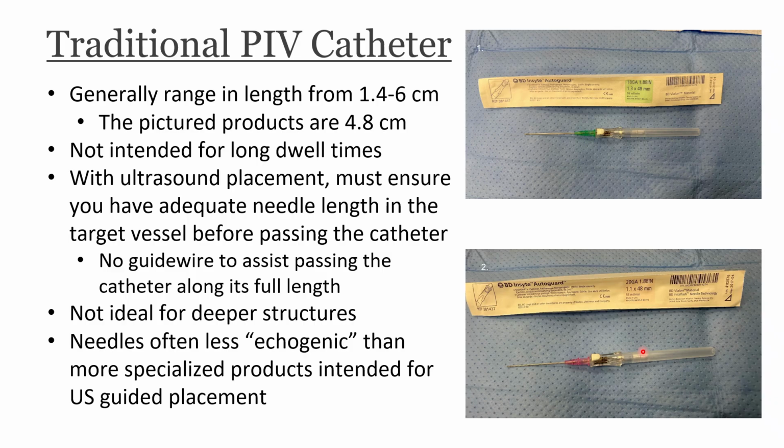They're not intended to stay in the vessels for a long time. We use a dwell time to map that out. So they're really more for just temporary access. You don't want to keep these in for more than days. Weeks might be stretching it, months, definitely not. If you're trying to place these with an ultrasound, you have to make sure you have adequate needle length in the vessel, or else you really won't get much catheter purchase.